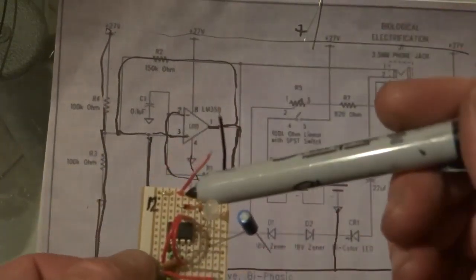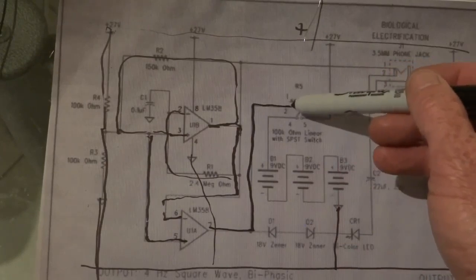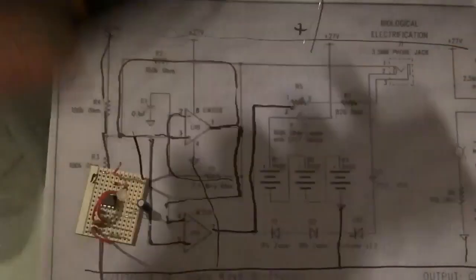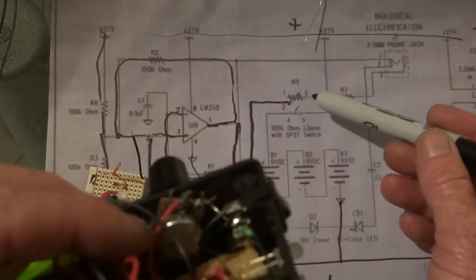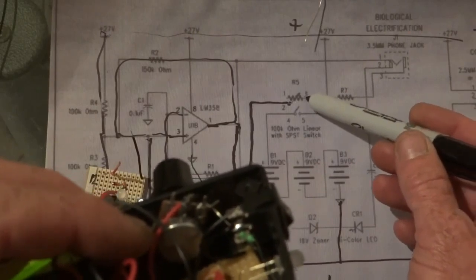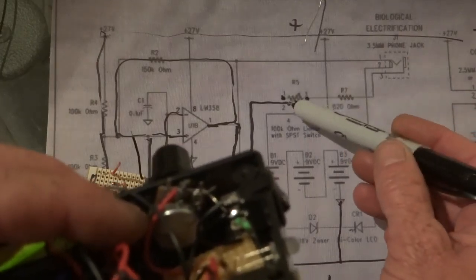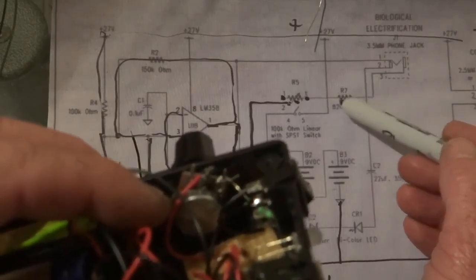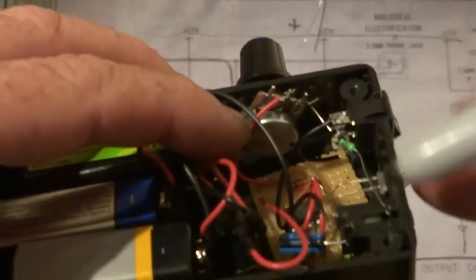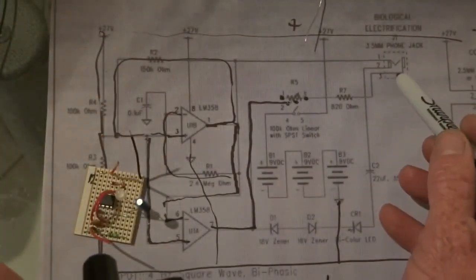Then we have the wire that comes out of number seven, and that went to the trim pot — the middle of that one there. Out the other side of the trim pot you have the middle and then the end pin. All of that goes to the middle; this one here goes to the 820k resistor, which comes from there up to the plug.